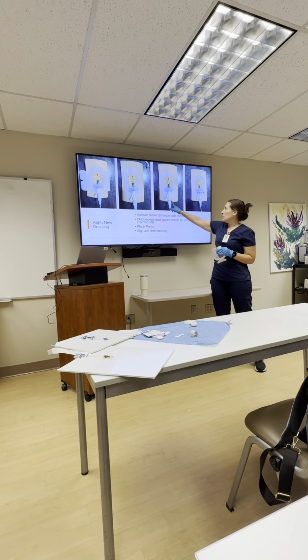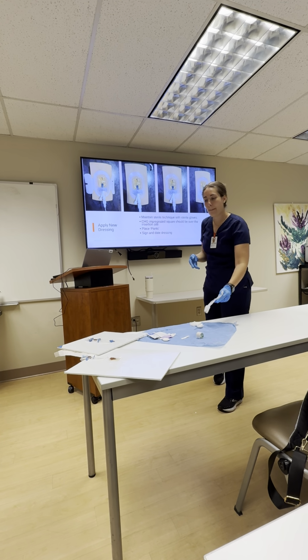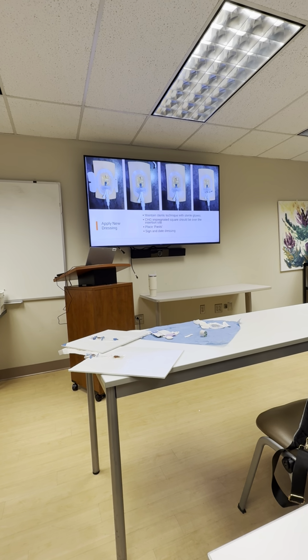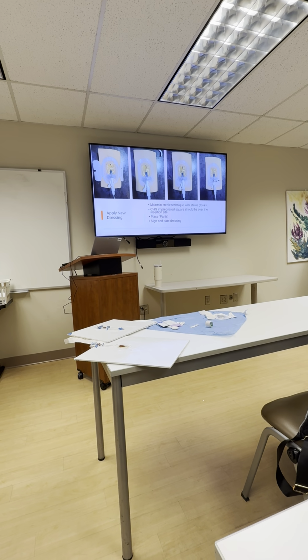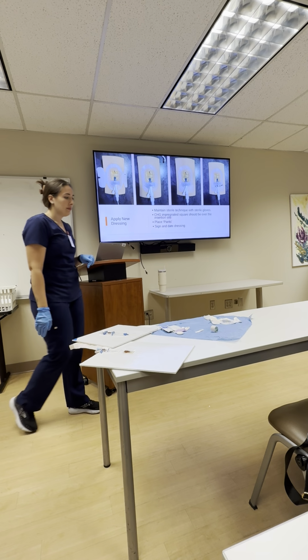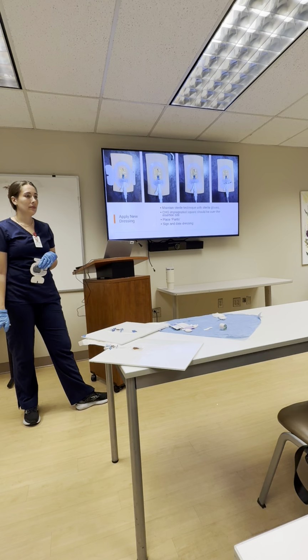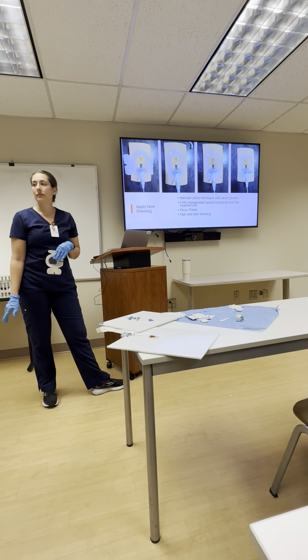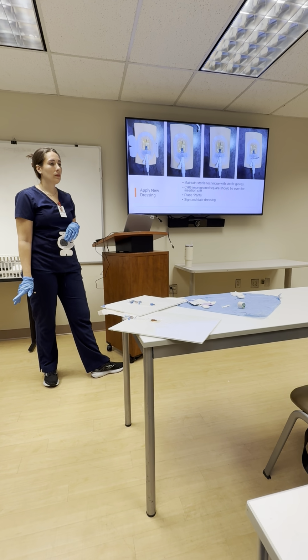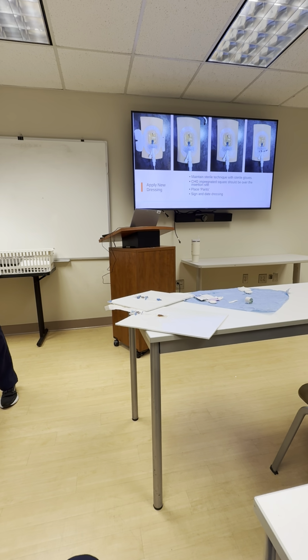And you're going to peel that off, and I like to place it underneath the catheter to help secure it a little better. Yep, right under the lines too.